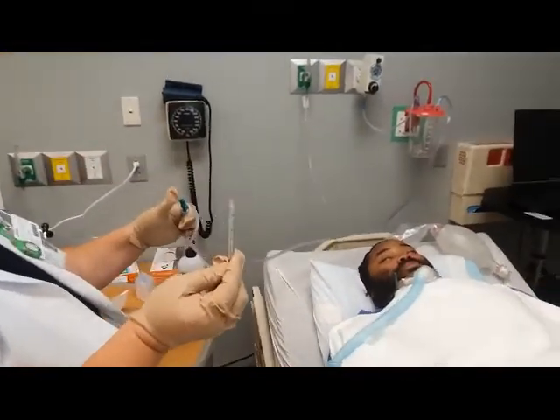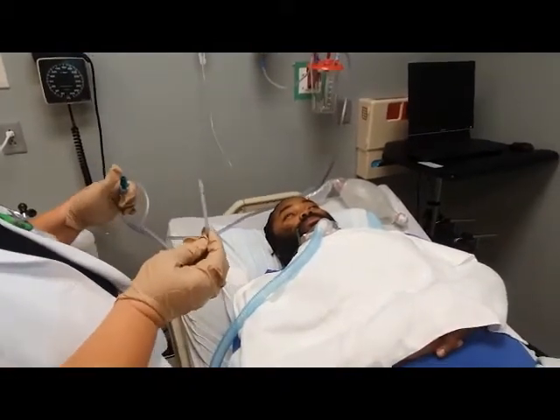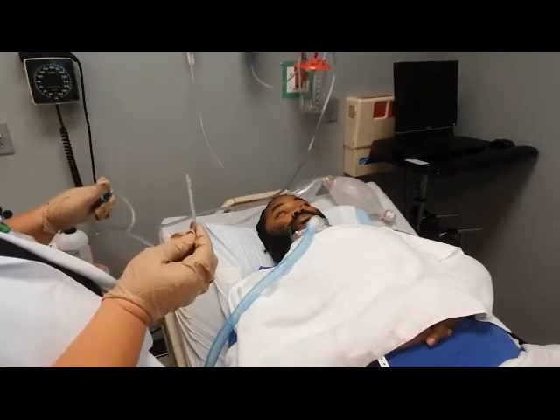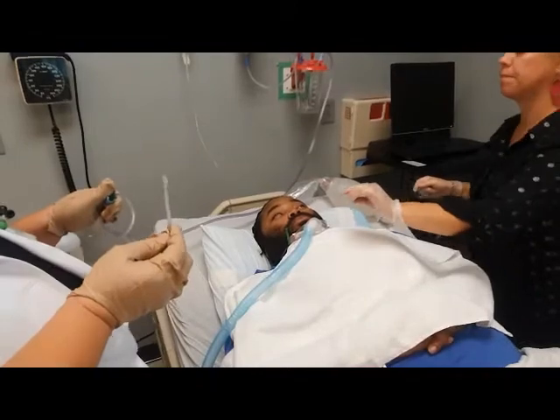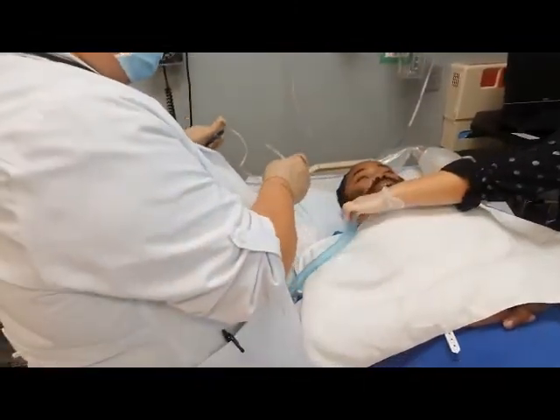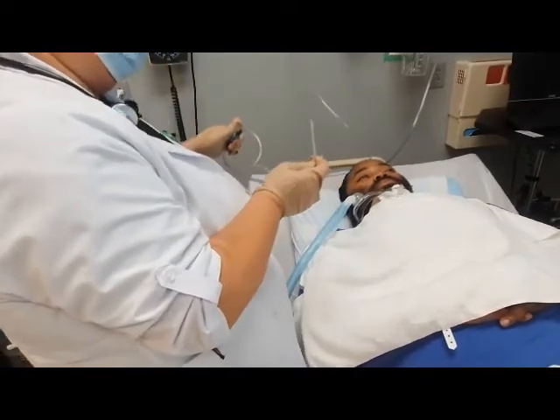If the client has a trach, remove the O2, have the client deep breathe and cough. Have your assistant hyperoxygenate the client with a bag mask, administering 5 to 6 breaths over 30 seconds. So at this time, this is when I had gotten the assistant earlier. She's going to remove the O2 to the side. Can you please take a deep breath and cough?